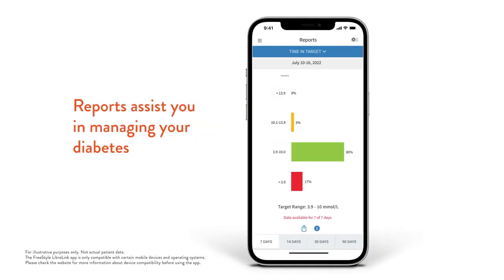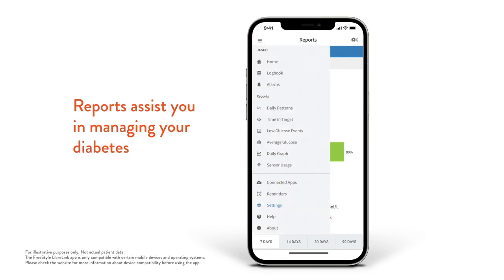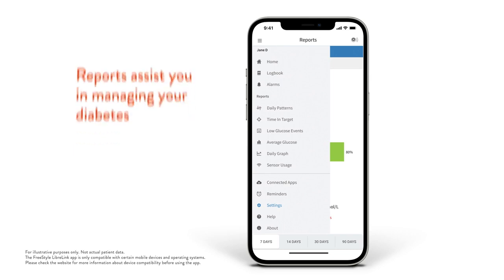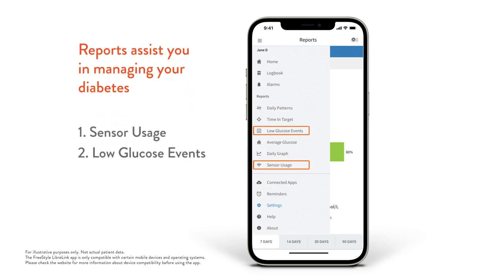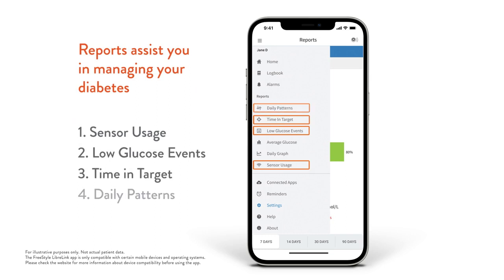To see your reports, click the Menu button in your Freestyle Libre link app. The reports we're going to look at are sensor usage, low glucose events, time in target, and daily patterns.